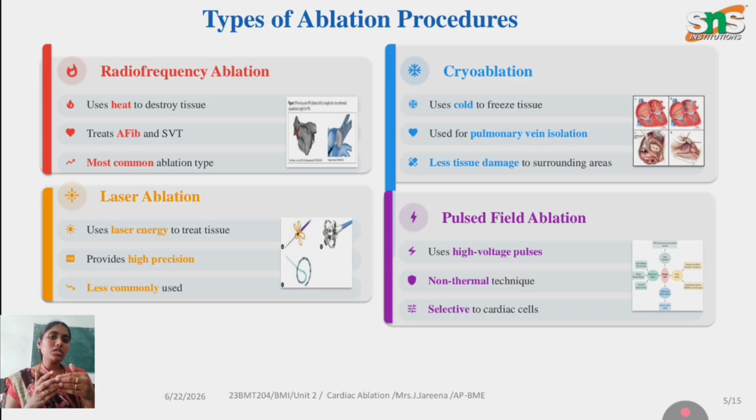Laser ablation, even though it is a very trendy, recent type of technique, uses laser energy to treat the tissue. It is less commonly used because it is expensive.